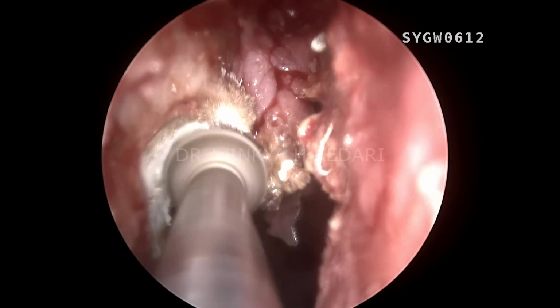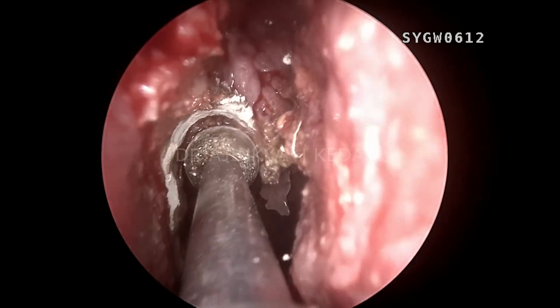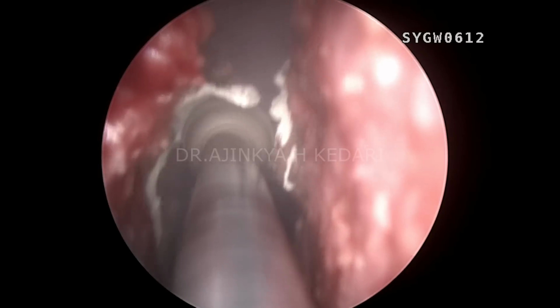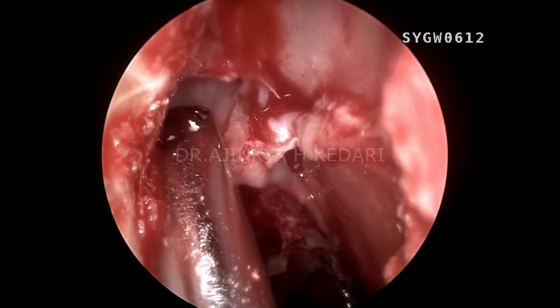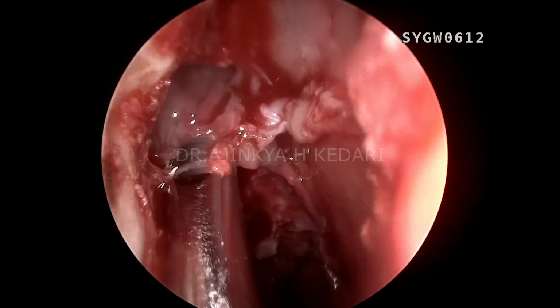After confirming the location of the first olfactory neuron, what you can see me doing right now is drilling on the frontal process of the maxilla. I'm going to keep on drilling the frontal process of the maxilla laterally and superiorly till I find the external skin. The limit is the external skin.